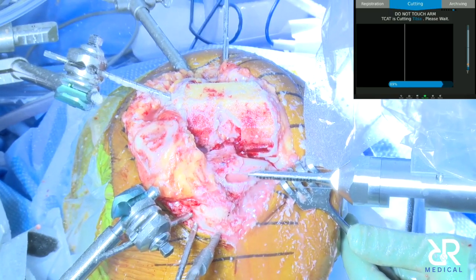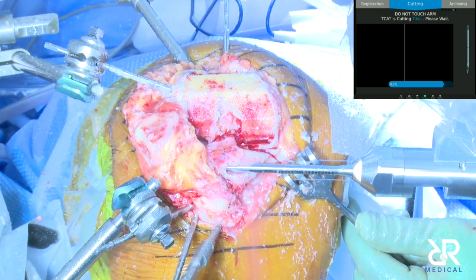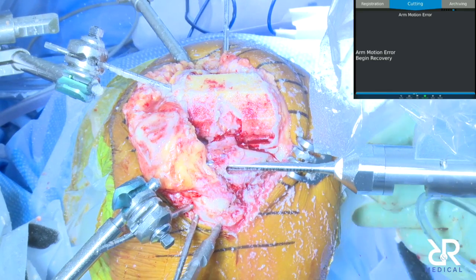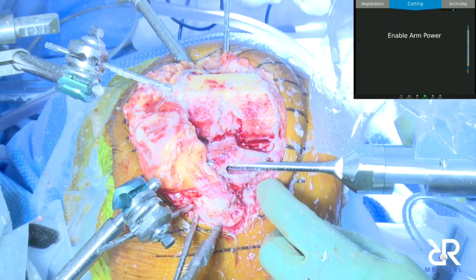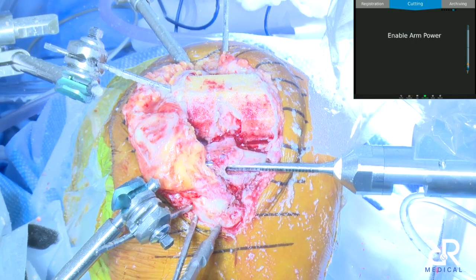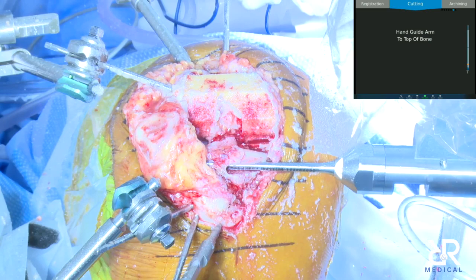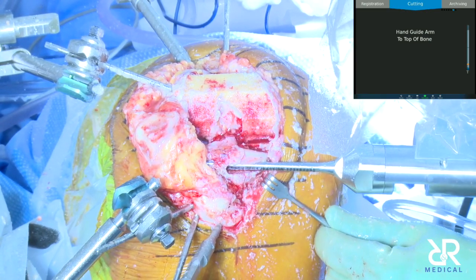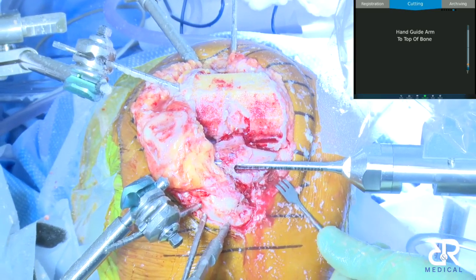When we did the IDE study, we used a different implant. Oops, I called a force freeze. Oh, do you have a Syn retractor? That's a non-starter, right? And so when we did the IDE study, we didn't have a single issue.